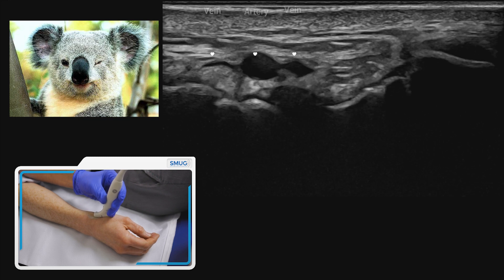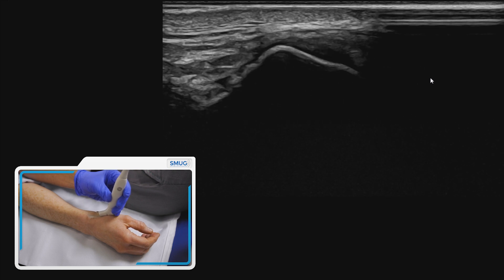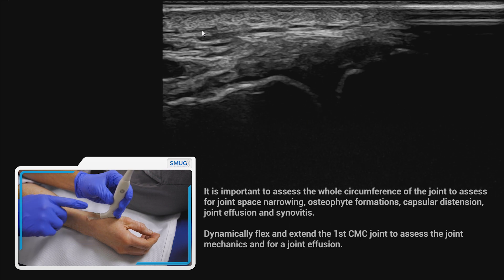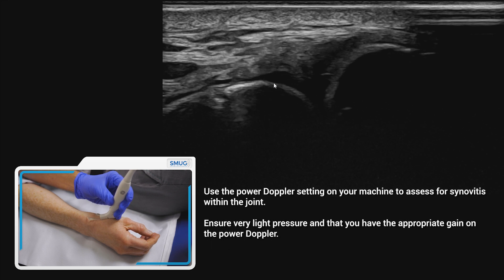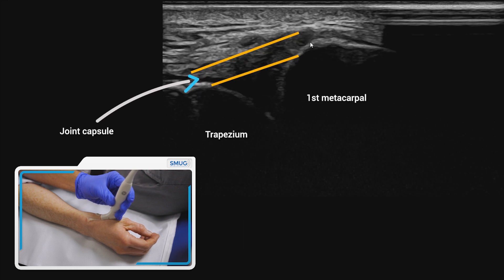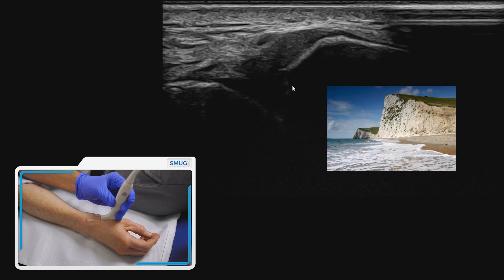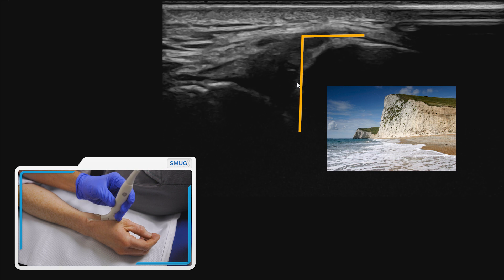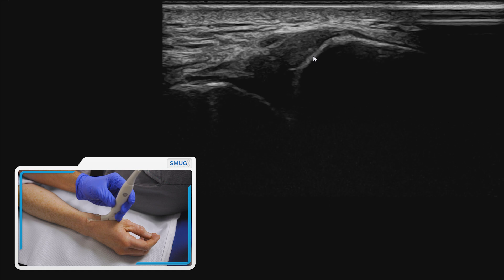You can find that and then as you slide further down, what you should find is a joint, and that's what we can see here. We need to bring the needle from this side of the probe, so we need to make sure that this part of the bone doesn't get in the way. If we bring it to one side, you can see here this is the base of the first CMC — and I call this the 'cliffs of Dover,' the white cliffs of Dover. If you're not from the UK that won't make much sense, but maybe we'll put a picture up so you can have a look. This is the end of the first CMC joint and this is what you need to find.